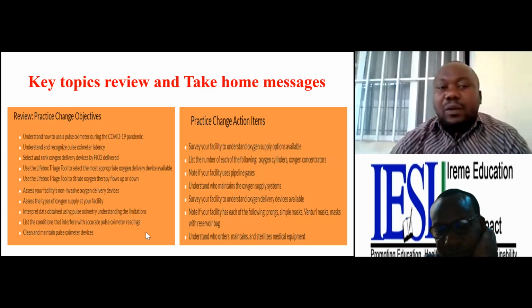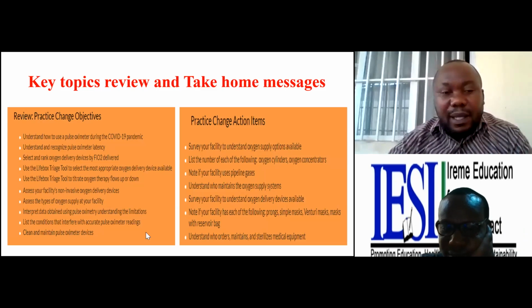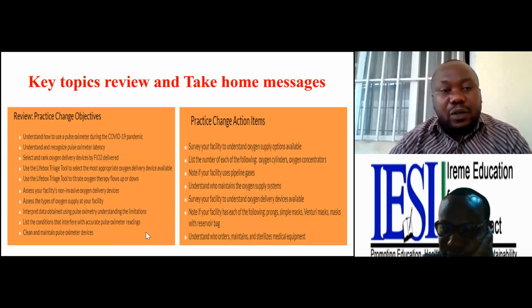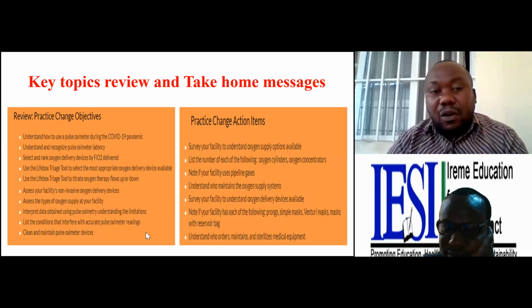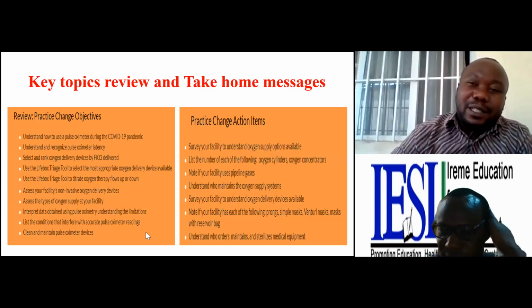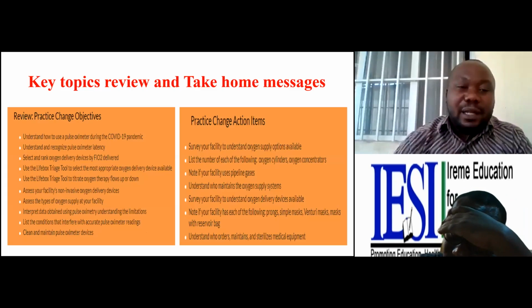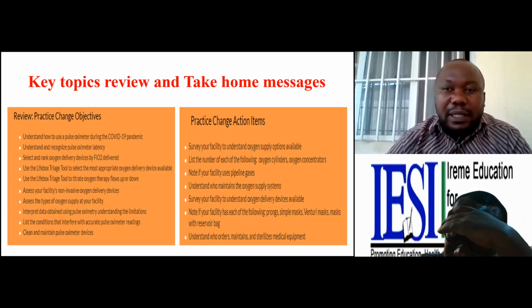Also go home knowing how to use oxygen delivery devices, from low flow oxygen to high flow, and know when to give how many liters, to avoid cost for nothing, and to be economical, but also not to fail to help the patient, like using a facial mask with a reservoir at a low flow of less than 10 liters, as we discussed.